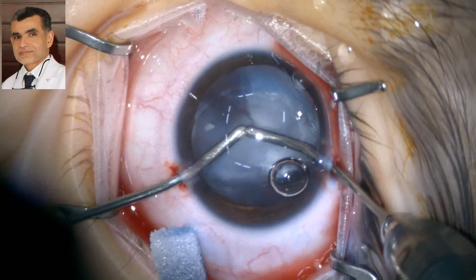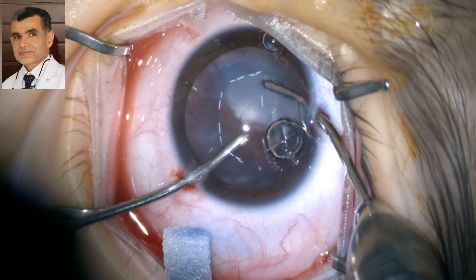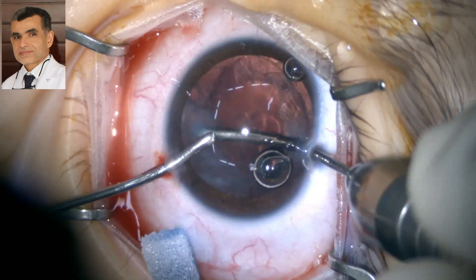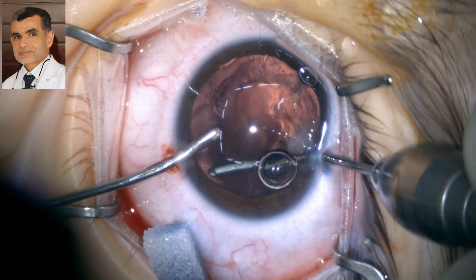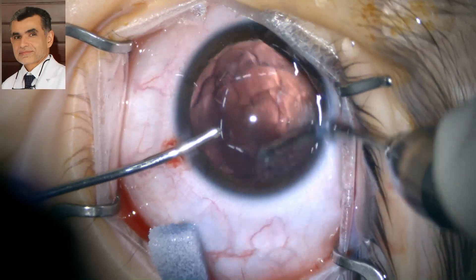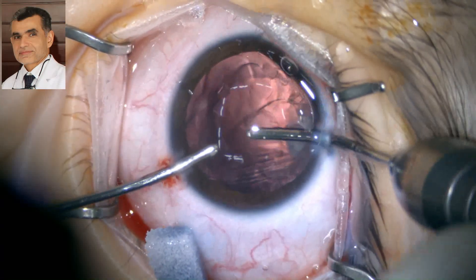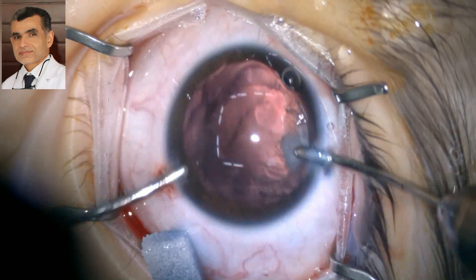Manual irrigation-aspiration was used to aspirate the lens matter. No phacoemulsification is needed in children, as we all know. It takes a few minutes to aspirate all the lens matter. In children we have to be very meticulous in removing all the lens matter and performing capsular polish to prevent opacification of the capsule — it will happen, but at least we try to minimize it as much as possible.